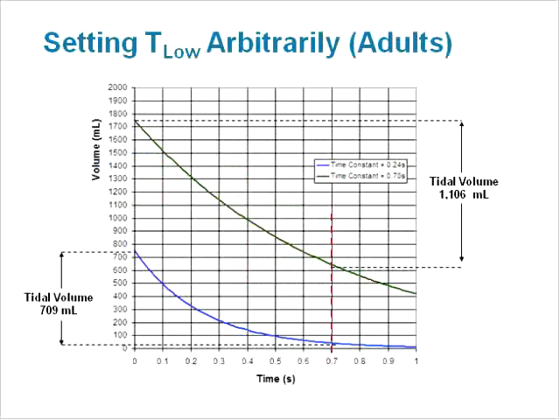I have, however, seen actual patient data showing mandatory tidal volumes in this range because clinicians fail to recognize that the so-called pressure releases are actually mandatory tidal volumes. This is the potential danger of thinking of APRV as simply 2 levels of CPAP with tidal volume generated only by the patient's spontaneous efforts.